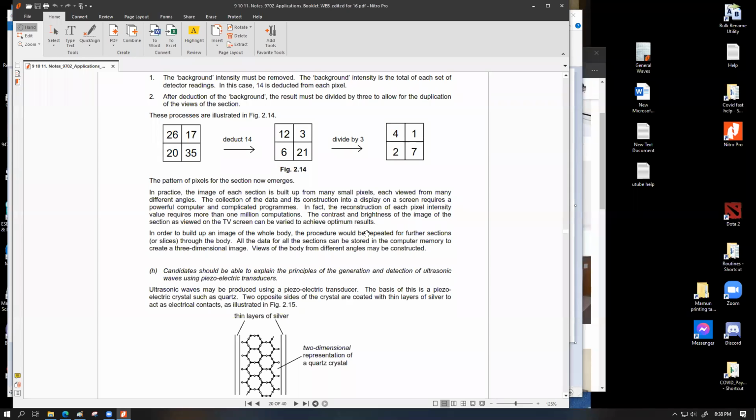If you want to think in terms of density, it is easier for us to understand, but it's not always density, because a certain tissue type can be physically less dense but more absorbent for X-ray beams. Cancer cells tend to behave that way. They don't have physically more density, but they tend to have more absorbing capability compared to other body cells. So the answer to your question is yes.